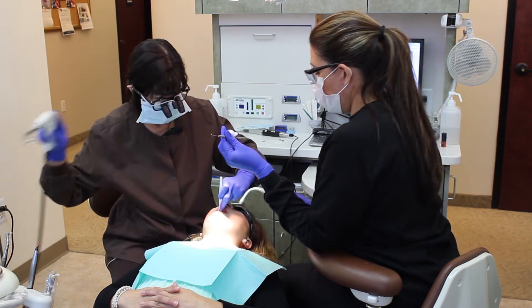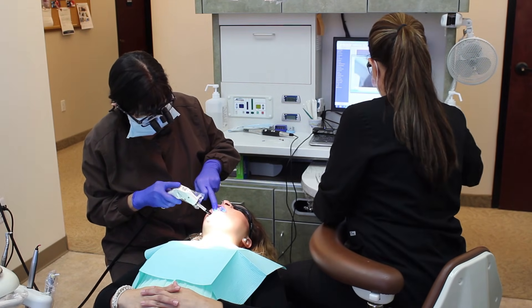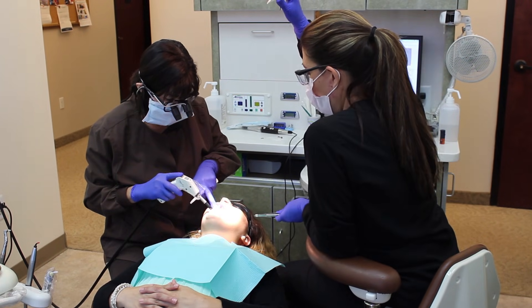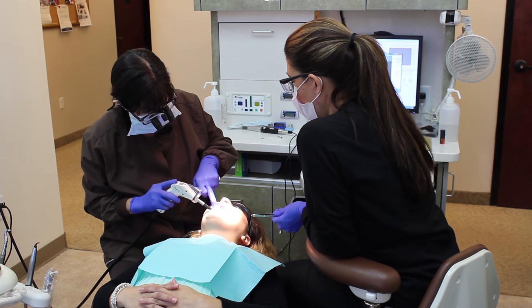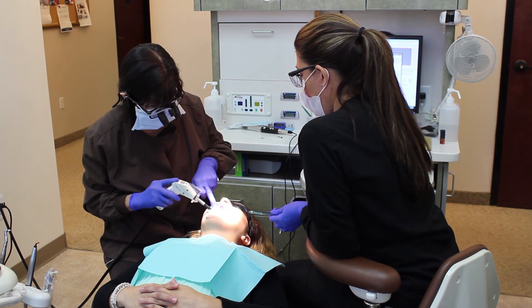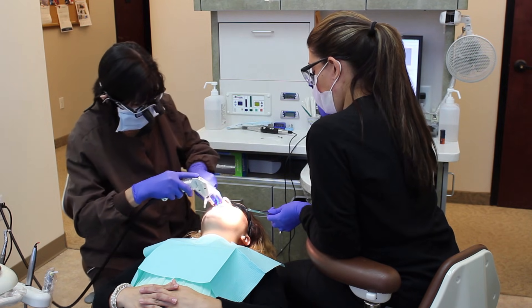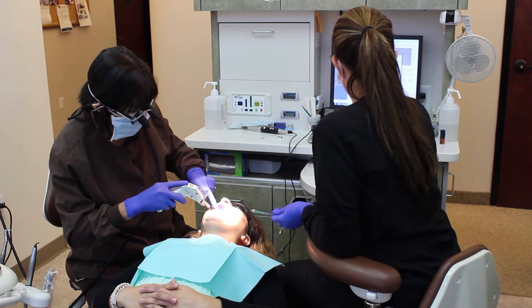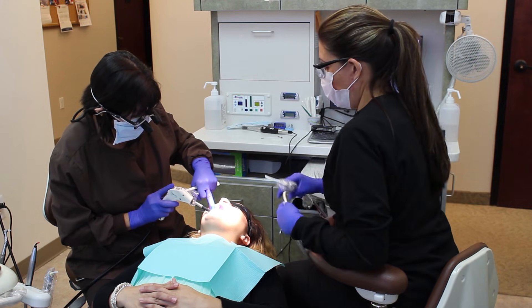I'm going to cure that. The great thing about composite fillings is they're strong — as soon as we cure them with the light, you can go ahead and chew with them. When we used to do silver fillings, we would have to tell patients to wait 24 hours before they could really chew with them for them to reach their fullest strength.